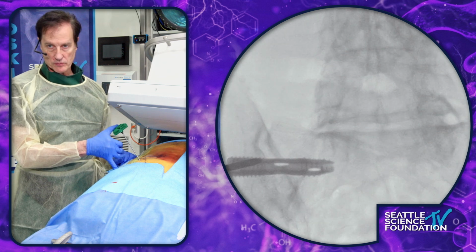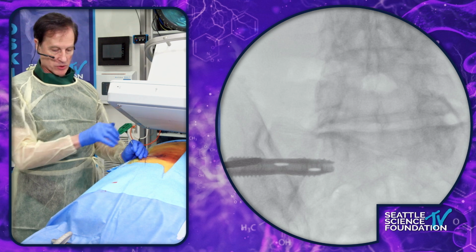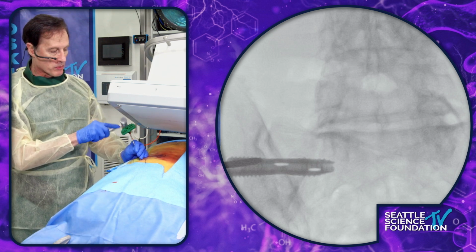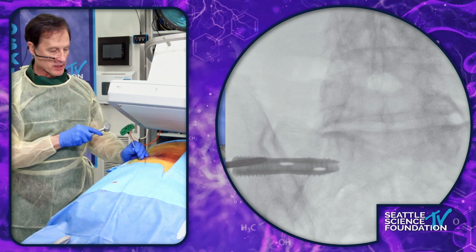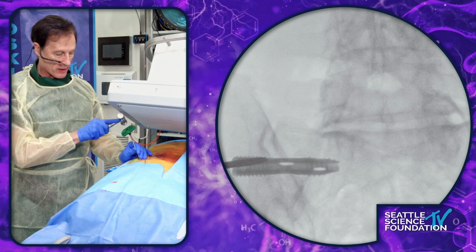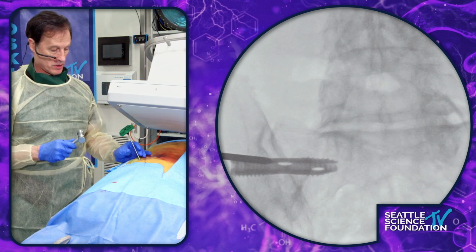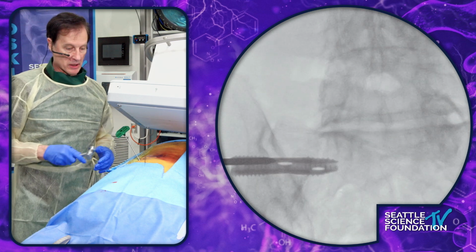Picture that. All right, so this is more dorsal, and it's out of the way of the gluteal muscles. This starts more dorsal. It starts just lateral to the PSIS and inferior to it. So you do have a built-in landmark that's pretty good. Picture that. Okay, good. And let's go to the inlet view.